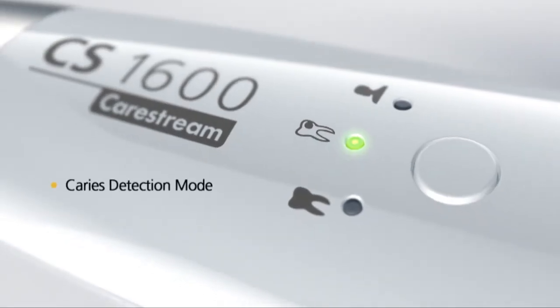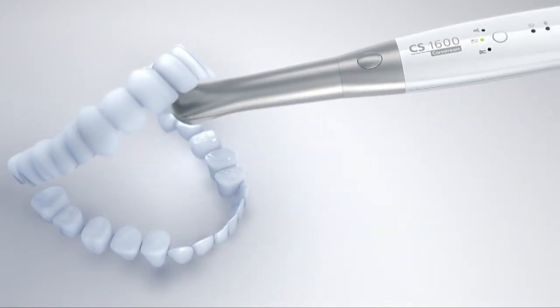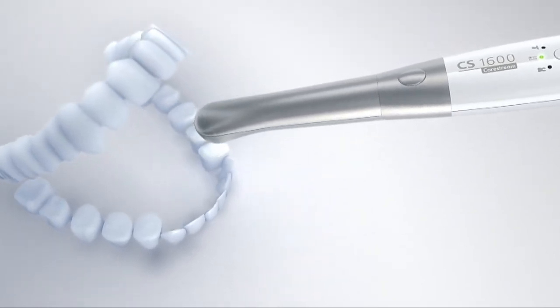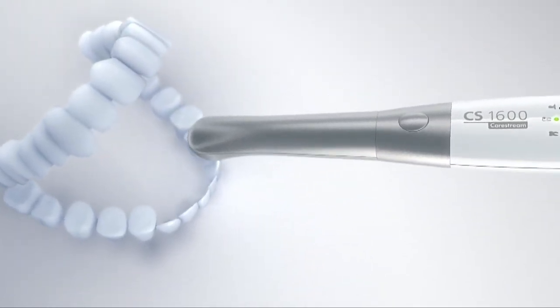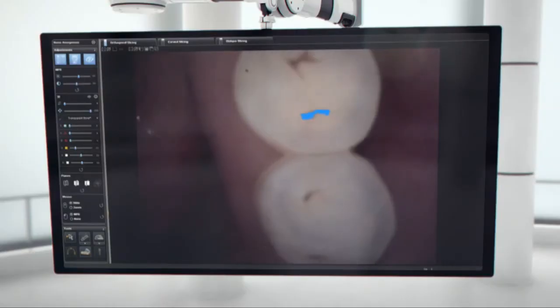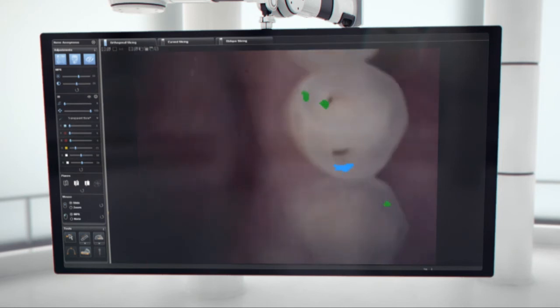Select caries detection mode for full analysis. Unlike other caries identification devices that require a separate and often cumbersome workflow, the CS1600 scans the patient's teeth during video screening. Areas of concern are highlighted with colorful visual and audio signals.